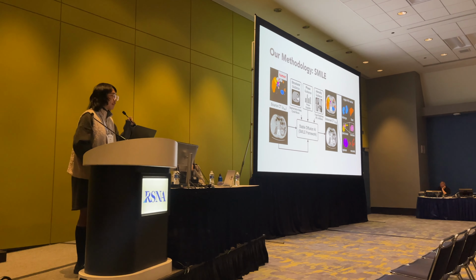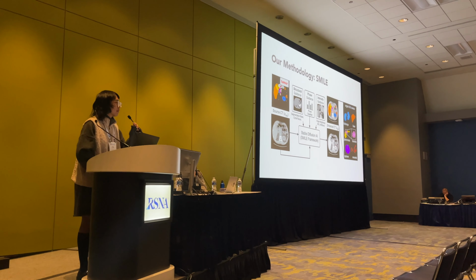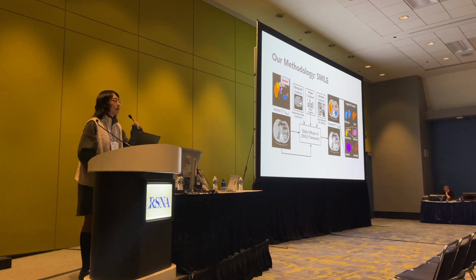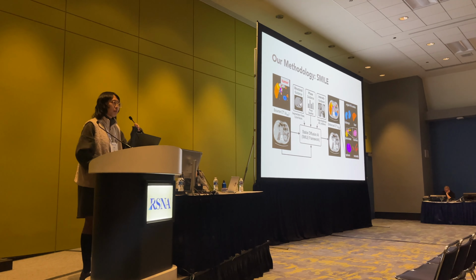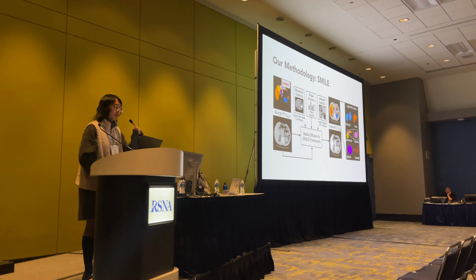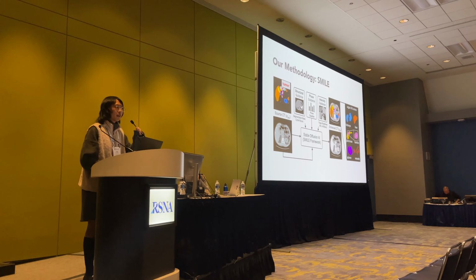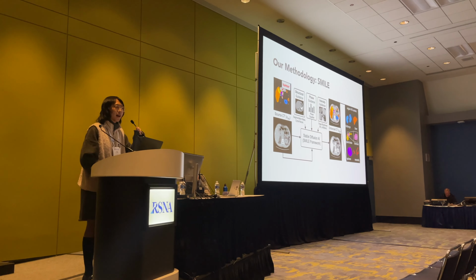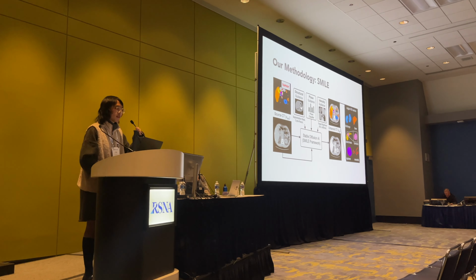Here, the structural guidance is done by introducing a segmentation mask, which includes the organ structures as well as the tumors, and ensures that in the training process, all the organs and the tumors are well preserved in enhancement. The second one is a classifier to ensure that we are enhancing in the right way. The third one is intensity, which is based on the knowledge that organ Hounsfield units will rise in different contrast phases. We use this as supervision in the training.